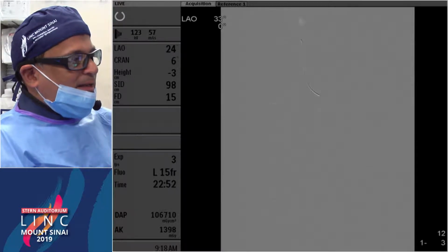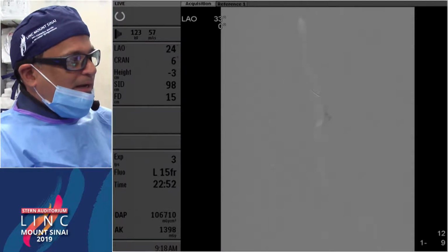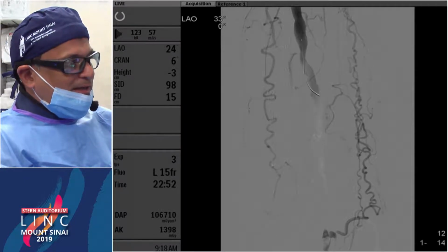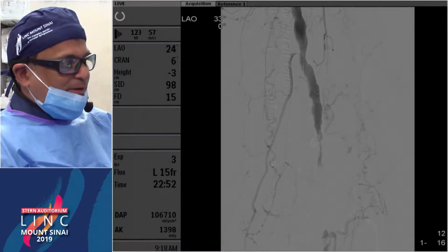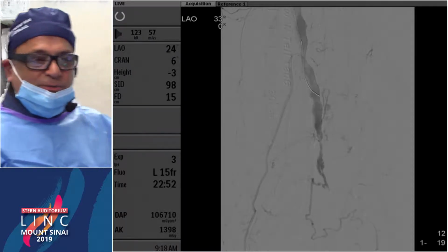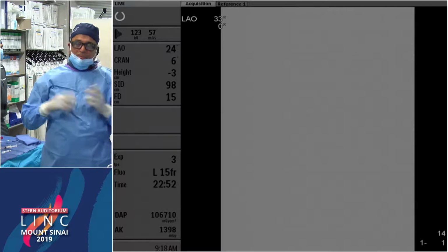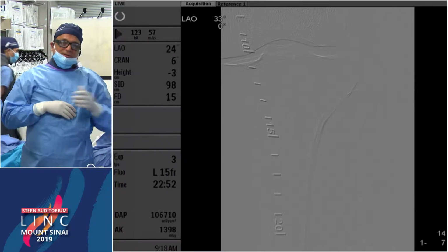And then in the last, I'd say, month and a half to 2 months, she's gone on and occluded her distal SFA at the level of the popliteal, and you can see by the flow. So at this stage, she has two-level disease. She has two-vessel runoff to the foot. She has two-level disease and now has progressed to rest pain.